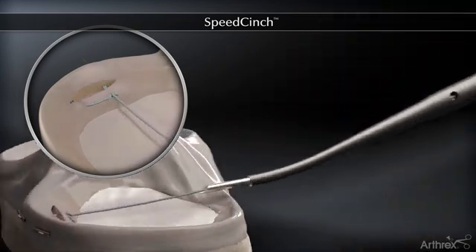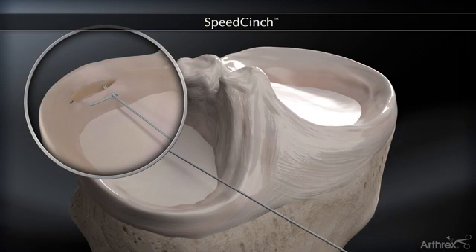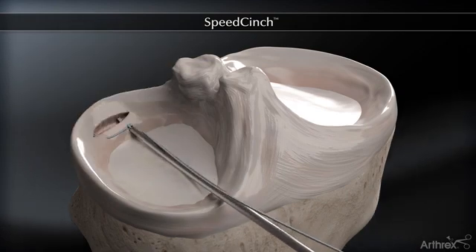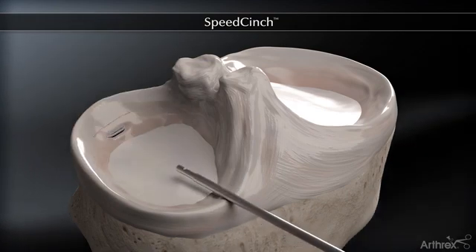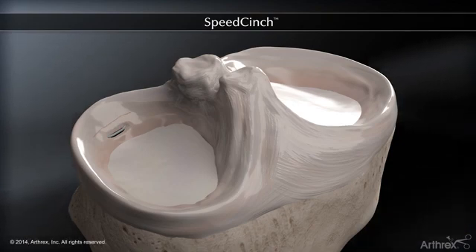Advance the knot pusher down to the meniscus to slide the pre-tied knot and tension the repair. Advance the trigger of the knot pusher to cut the suture tail.